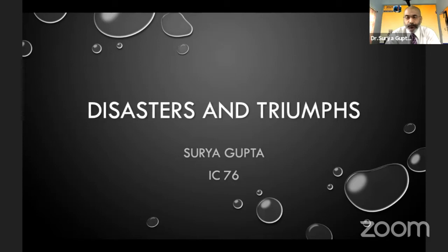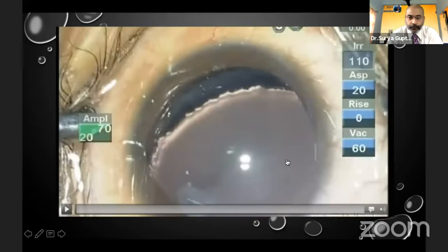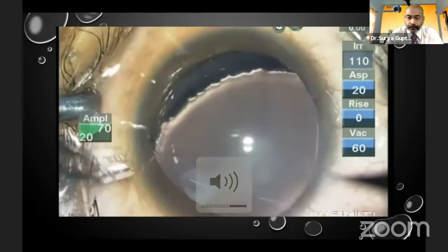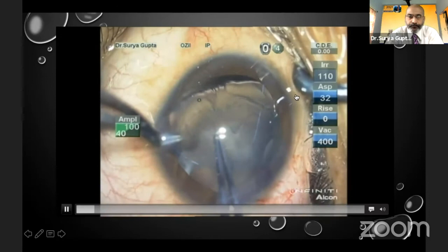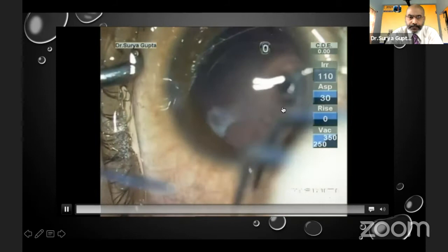So, talking about disasters and triumphs, I would just like to share a couple of videos. In my first video, this is a young adult with a traumatic cataract, and you can see that this area is the subluxation. So I do a Rexis, but the capsule is quite elastic for two reasons. It's a young patient, and secondly, this area here doesn't have any zonular support. But finally, I get a good Rexis. You can appreciate the Rexis is very well centered to the pupil.